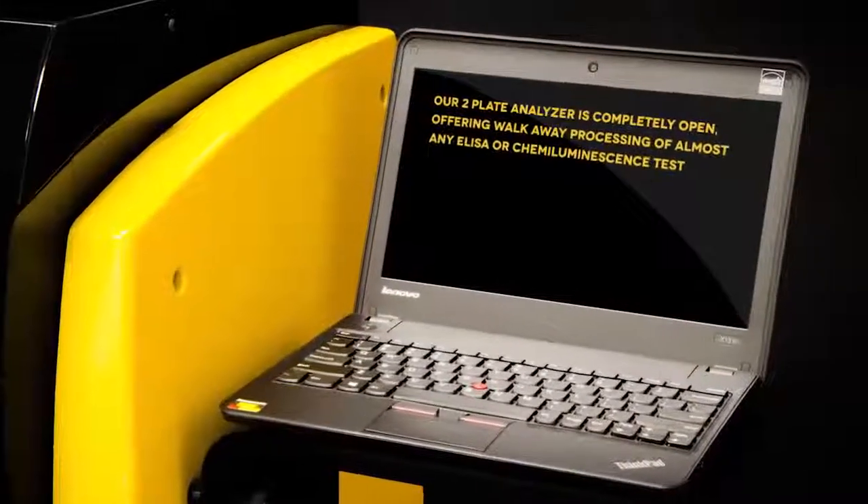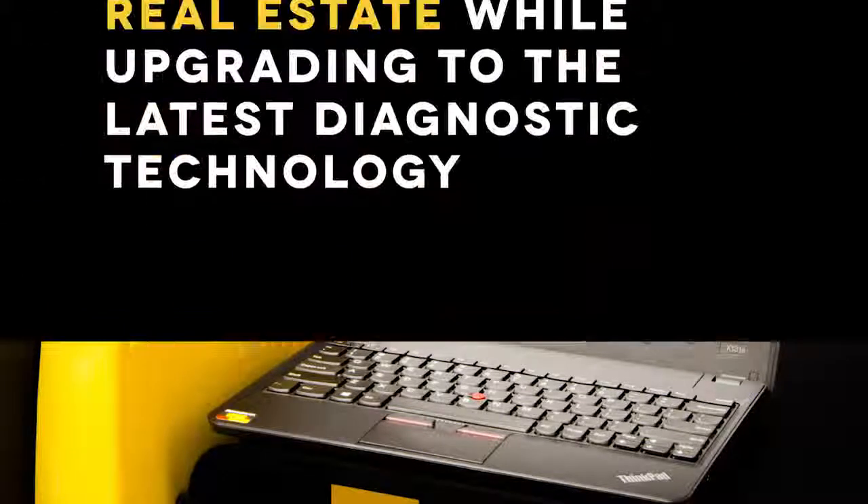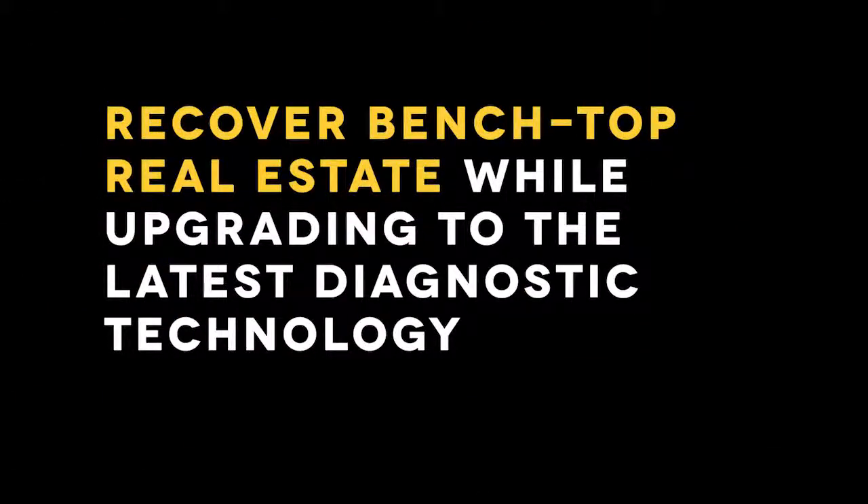Our two-plate analyzer is completely open, offering walk-away processing of almost any ELISA or chemiluminescence test. Recover benchtop real estate while upgrading to the latest diagnostic technology.